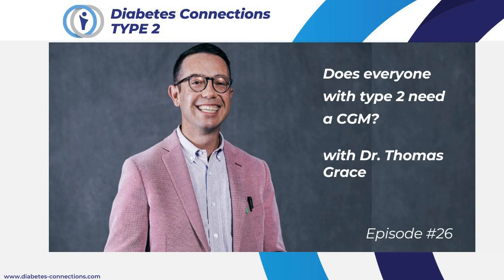And, like, I'm a mom of a kid with type 1. So our perception of what we get out of a CGM is a little bit different. You already mentioned alerts and alarms and things that are not on Stelo. So I'm thinking, is there technology here where a person wearing Stelo can see their numbers and then also easily get it to their clinician? Even an over-the-counter version of this, they can either show it to a doctor or download in the office?